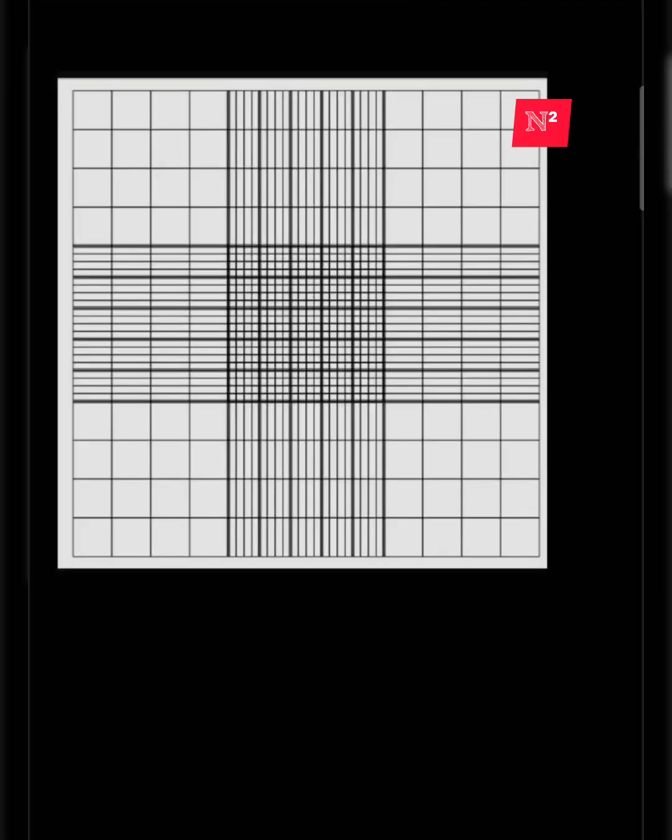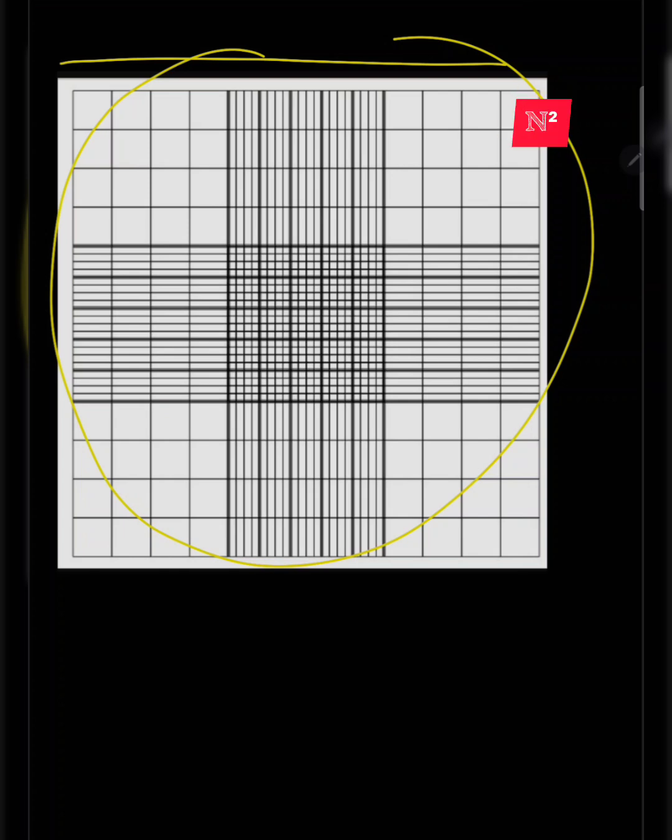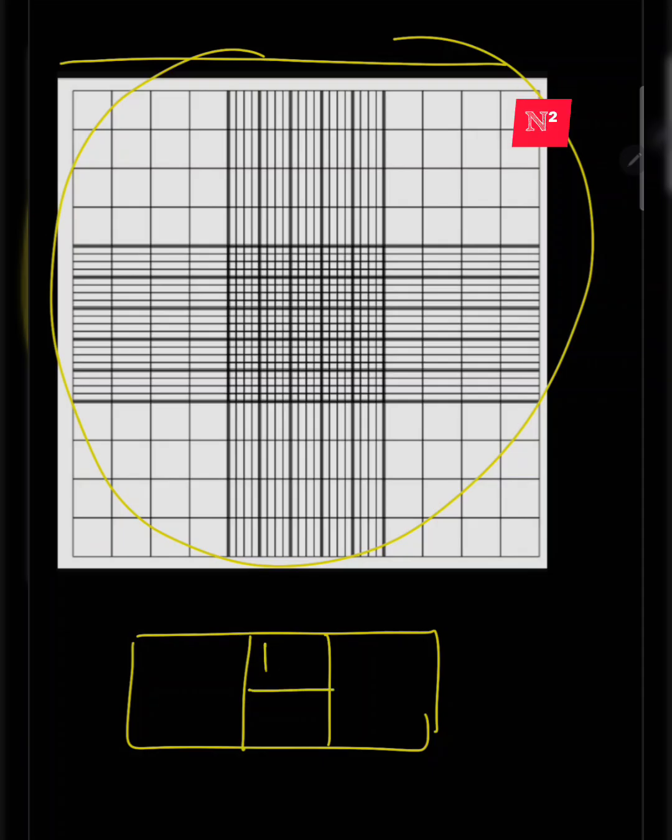Inside the central platform of the improved Neubauer hemocytometer slide, you will get the grid, which looks like this. I told you in a hemocytometer slide there is an H-shaped groove. This H-shaped groove divides the central depressed platform into two distinct areas. Now if you look closely under the microscope, you will see grids. In one hemocytometer slide we get two such grids.